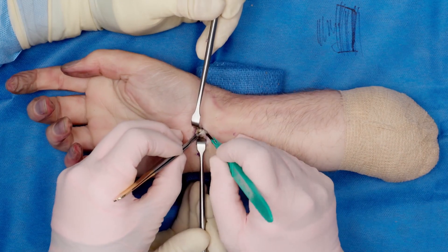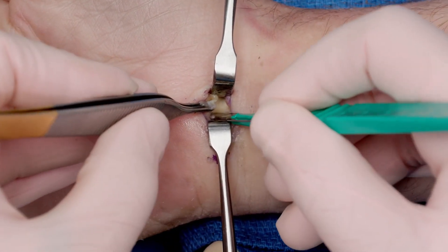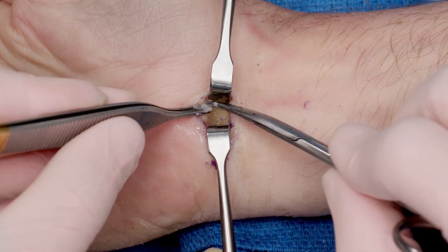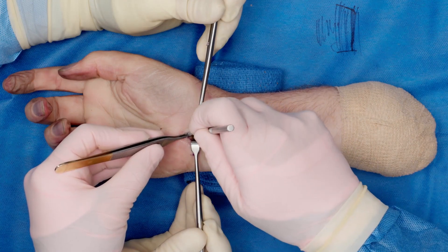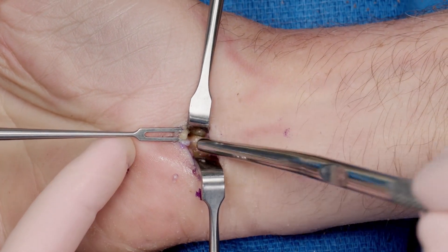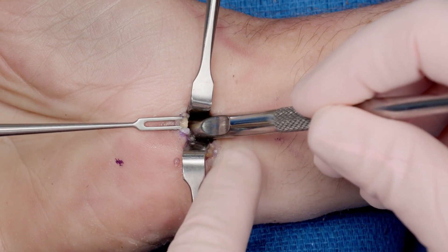I take my knife and make the U-type flap with cuts on the side. After I have that flap, all the fat that's pooching out and in my way, I can pull that back so I have a nice pathway to the canal. I take a two-pronged skin hook and now I have a great view of the nerve as well as the canal. We can take our dilator and dilate up that canal — you can really push on the hamate. I always hold the retractor on the ulnar side to make sure my ulnar neurovascular bundle is protected.